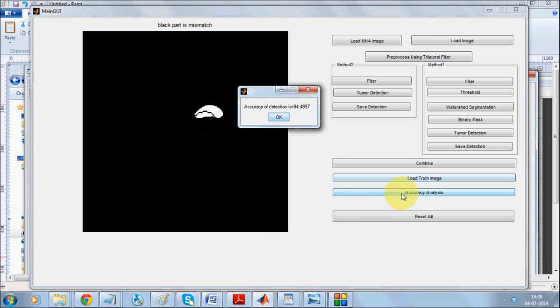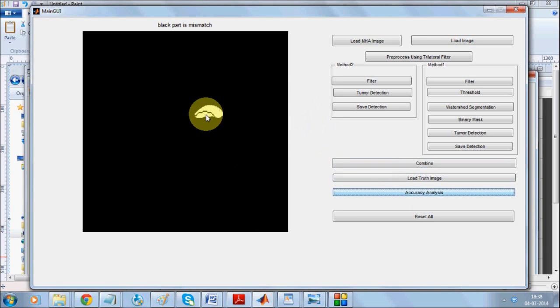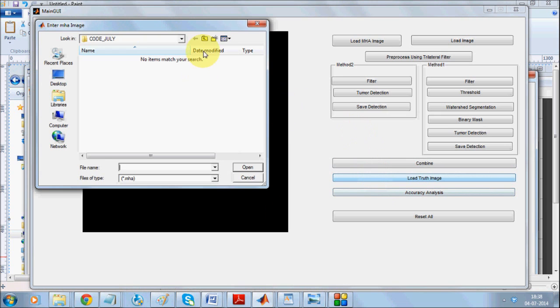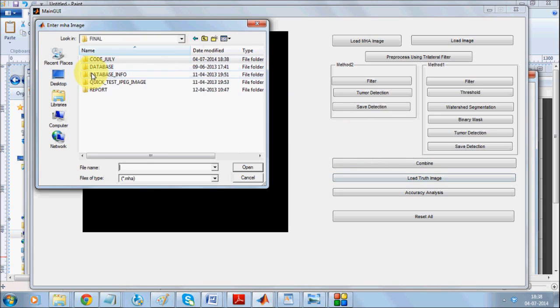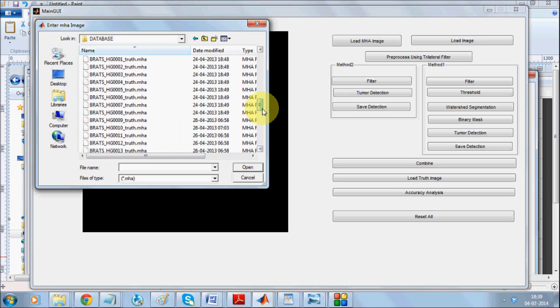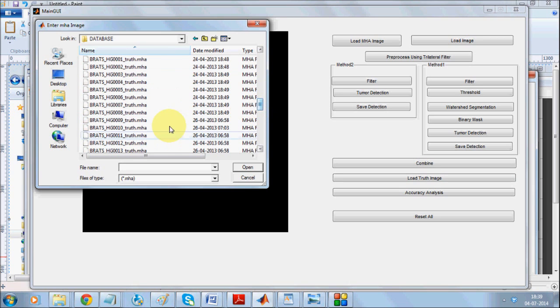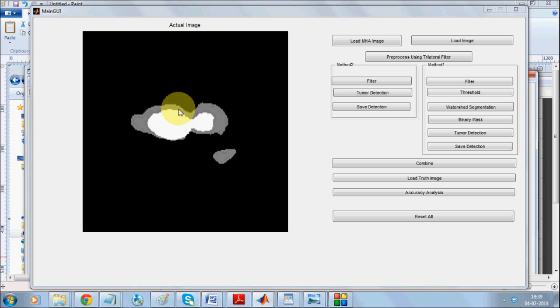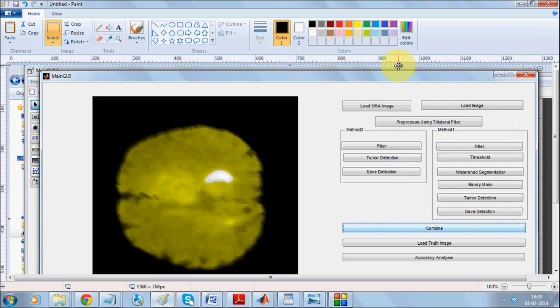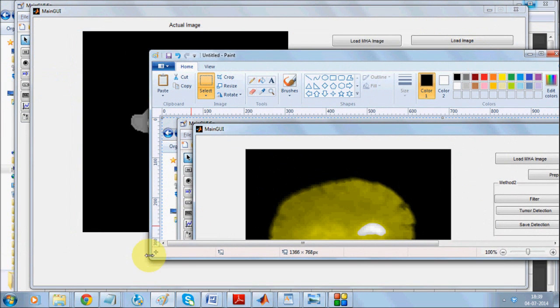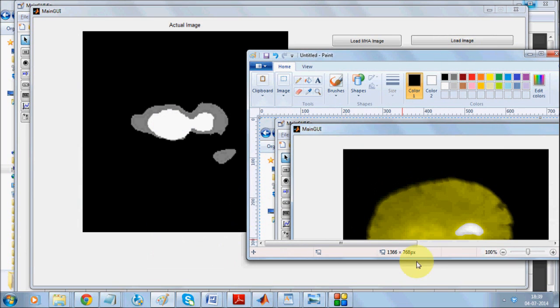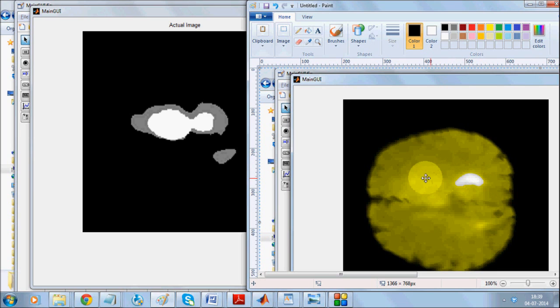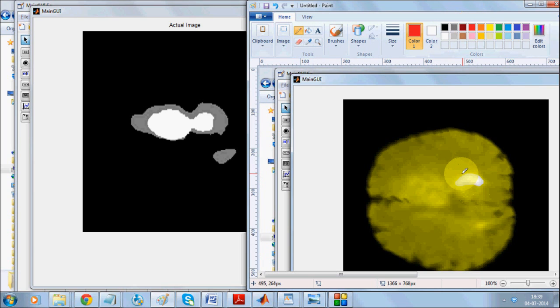Let's check accuracy analysis. It's about 98 percent. This is the area that got detected. I'll be again loading the truth image so I can compare it. This is the area that is getting detected now. Observe this part, out of this entire area it has detected this constantly. However, the original truth image says this whole area comes under tumor.